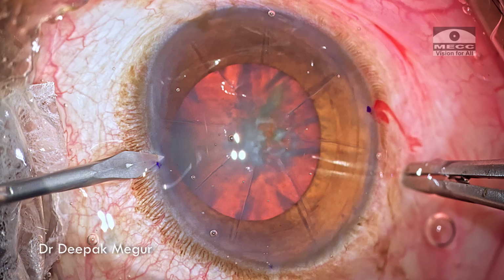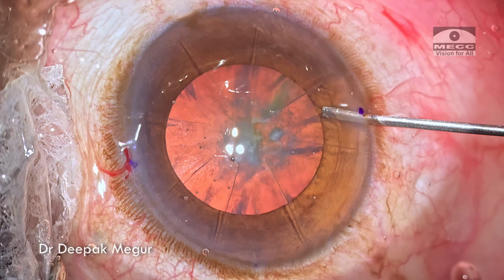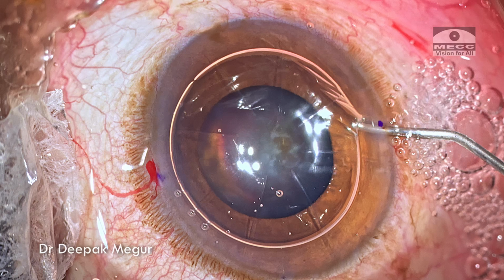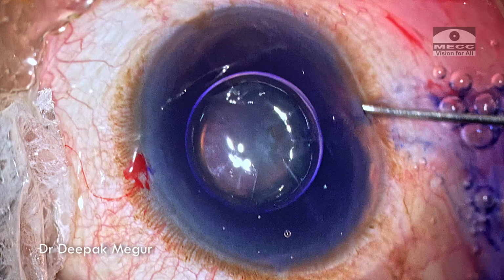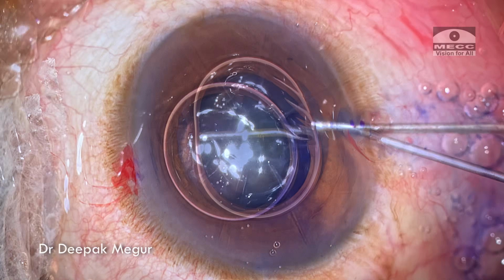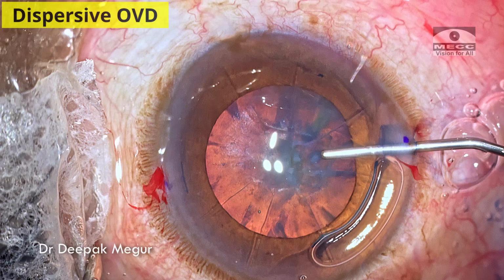So I begin the surgery by creating two side port incisions. Air is introduced into the eye, followed by intracameral lignocaine, and then trypan blue is used to stain the anterior capsule. The pupil is not extremely well dilating, but it should suffice. The chamber is pressurized with OVD and it is time to perform the main incision.